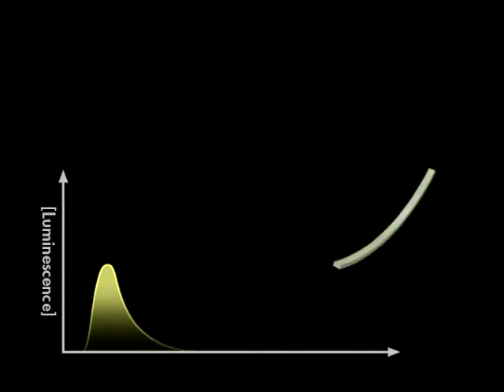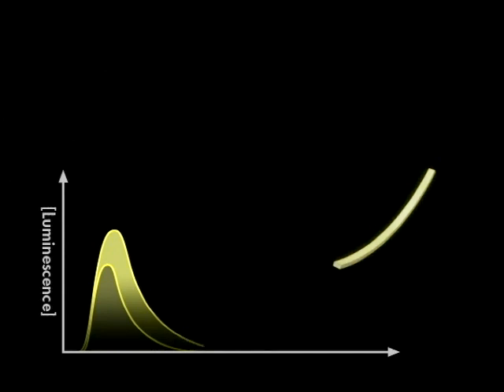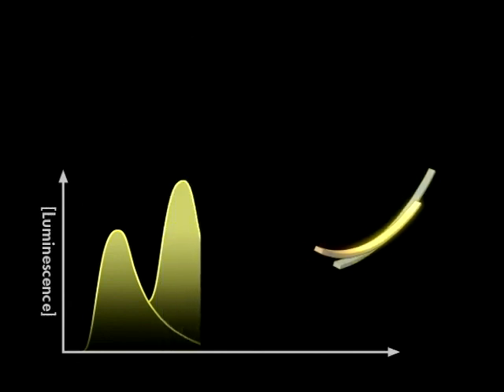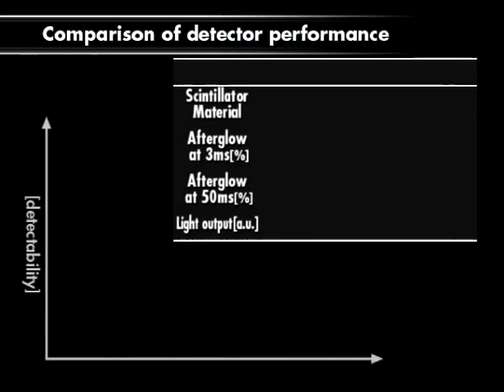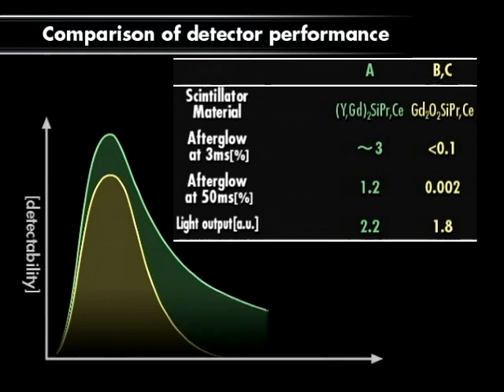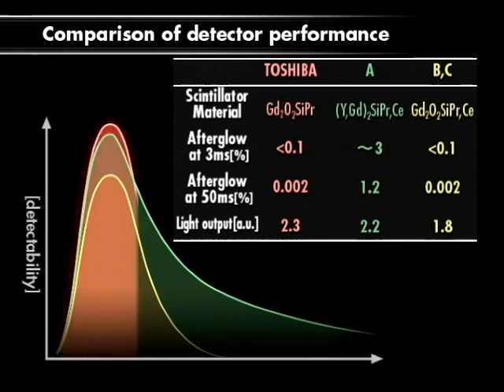Strengthening the detector light output to improve image quality results in a longer afterglow. If the afterglow is long, the data acquired will overlap with subsequent data so that image quality suffers. Shortening the afterglow without hurting image quality, another challenge to overcome in achieving the half-second, half-millimeter slice.